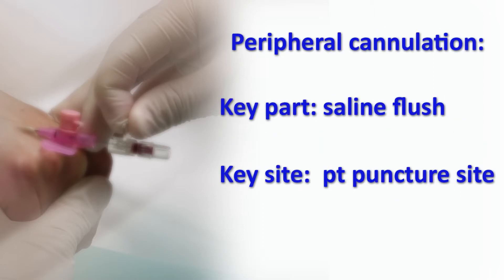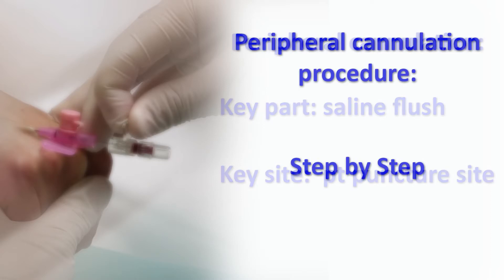In peripheral cannulation, these are the parts that will come in contact with the saline flush and the patient's puncture site. Peripheral cannulation procedure step by step.